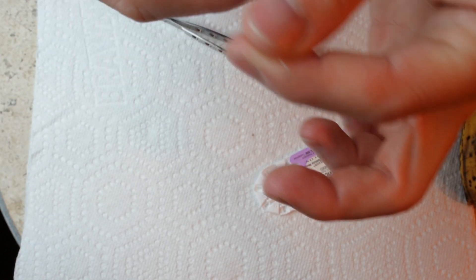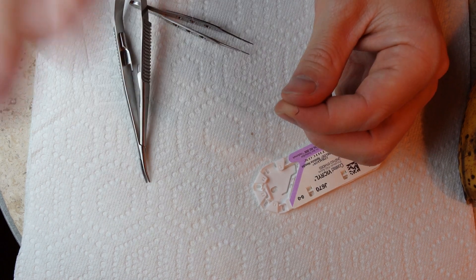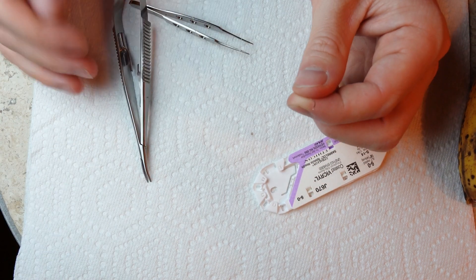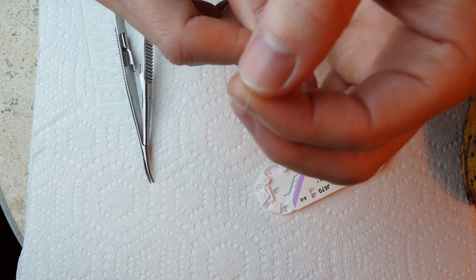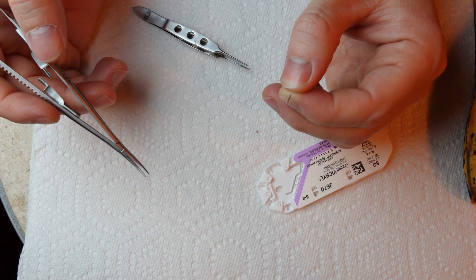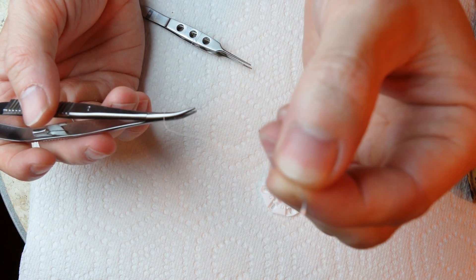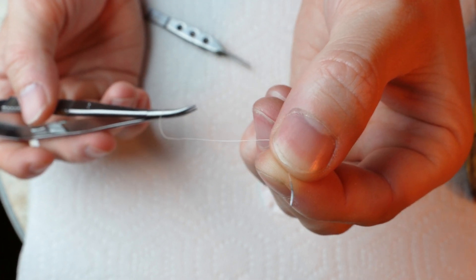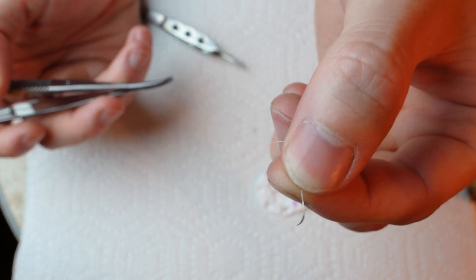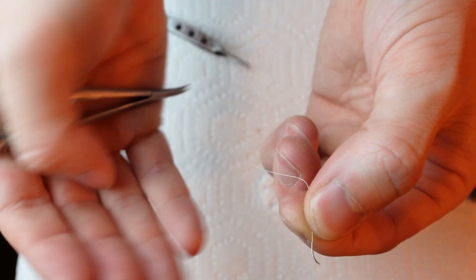The key here depends on what direction we want to throw the needle. If we want to do a forehand pass — throwing it this way — we need to load the needle a certain way, as opposed to if we want to throw the needle backhand, we load it a different way. The easiest way to remember is with the little acronym FDBU — funny ducks by underwear — or insert whatever words make more sense. FDBU: forehand down, backhand up. What I mean is: if I'm going to do a forehand pass, I'm going to point the needle down — forehand down. If I'm going to do a backhand pass, I turn the needle up — backhand up. So needle facing down for forehand, facing up for backhand.